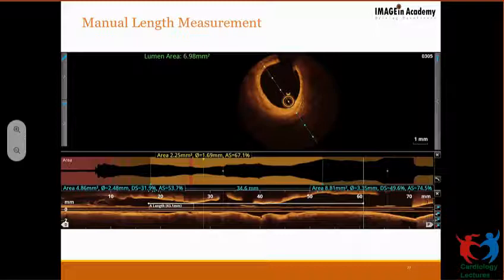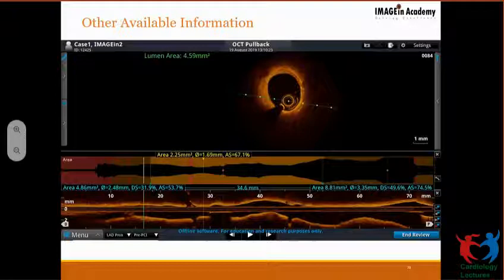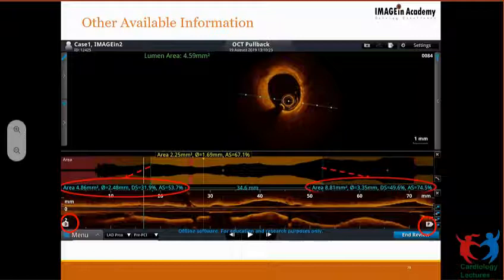The more you play around with the buttons, the more comfortable you'll get with the machine, and the more information you'll be able to derive from it. There are other information parameters available. These are the proximal and distal markers which give you the area. The maximum and minimum luminal area also gets highlighted automatically and will tell you where the minimal luminal area is located. You have the proximal and distal reference, everything coming out automatically.